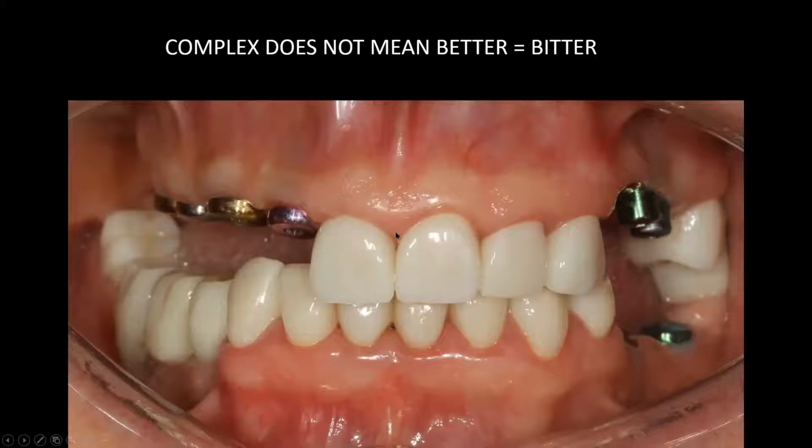I know what Stan's looking at, but I'm going to answer for Stan, and he can come in in a minute. From my point of view, this is a real concern, that last tooth here. And you know what's going to happen here, right? When you build these teeth down, that's going to be banging on those, right? That's going to be really interesting.